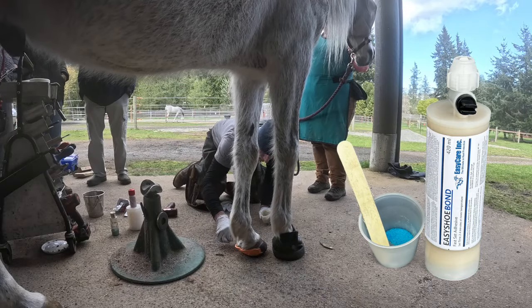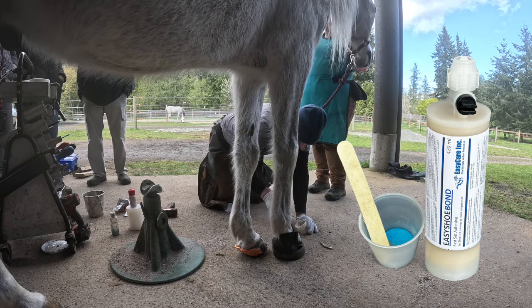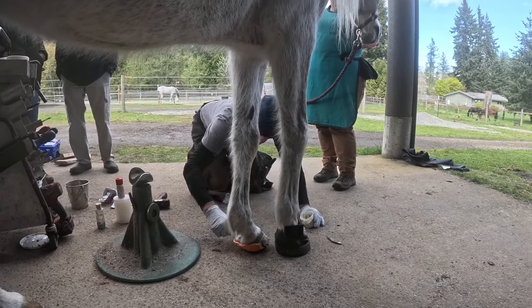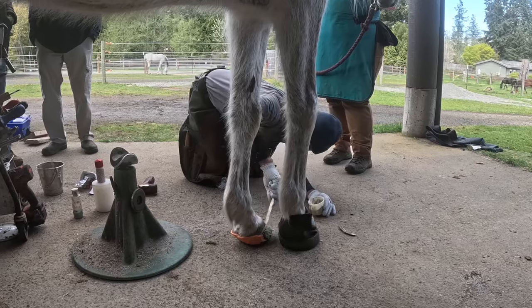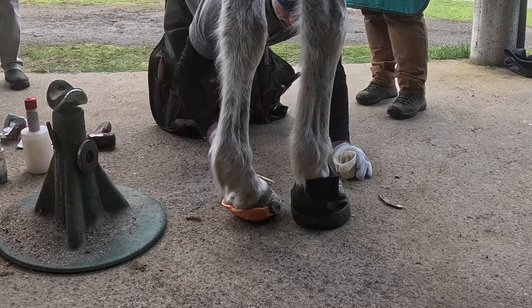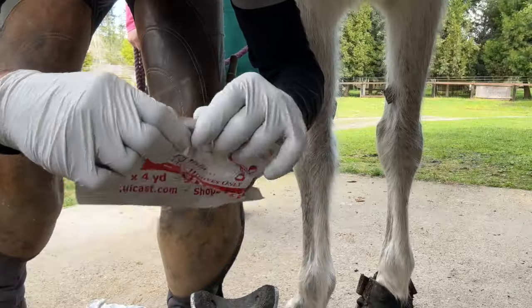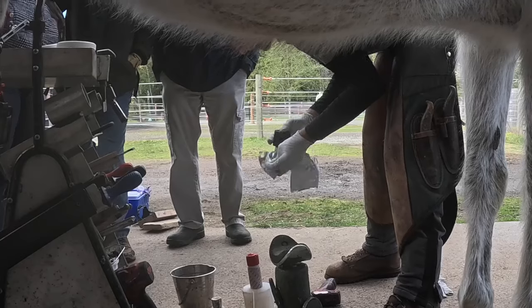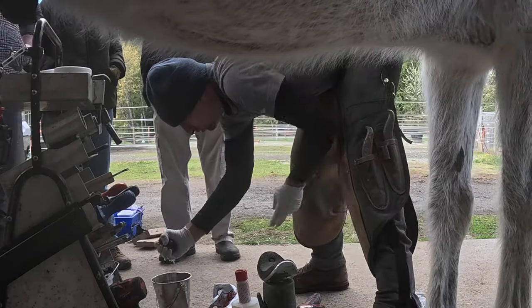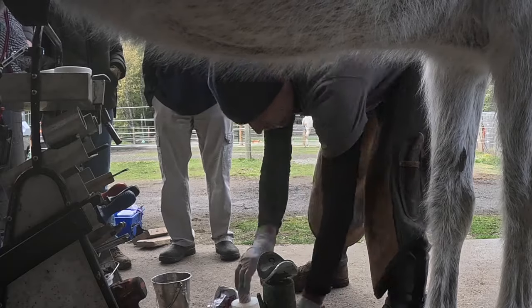I just ice the cake fairly primitively, about two-thirds of the way up normally. If I go all the way up, then it oozes out and gets on the coronary band, and then I've made a mess and have to clean up. You don't put it over the impression. I don't, no. And I don't squeeze all the water out, because that's what helps it cure.